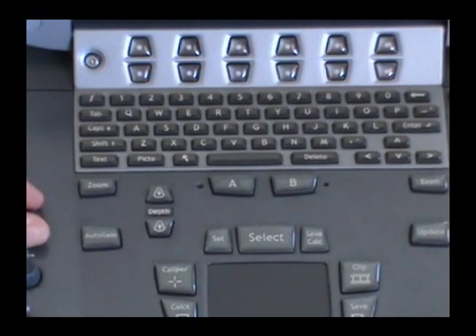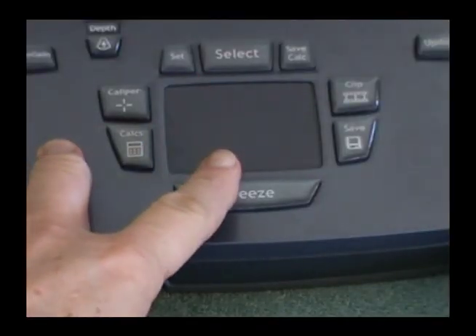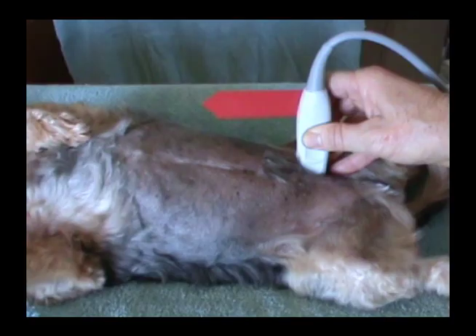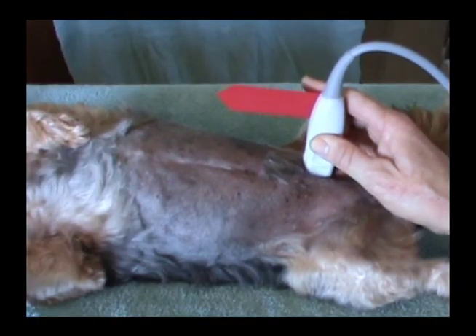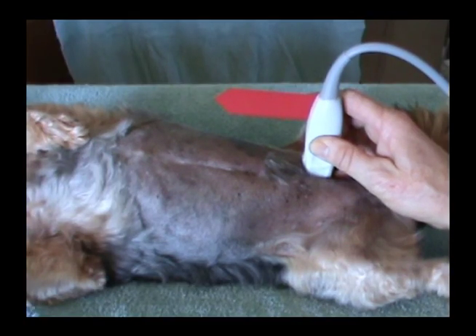Adjust gain for the best image, and adjust focal points to the bottom of the organ of interest. Remember to keep one finger of the keyboard hand on the freeze button ready to capture the best image. When you press the freeze button, practice leaving your transducer hand relaxed and in position so that when you unfreeze you will still have the same image. This will save you time and effort.